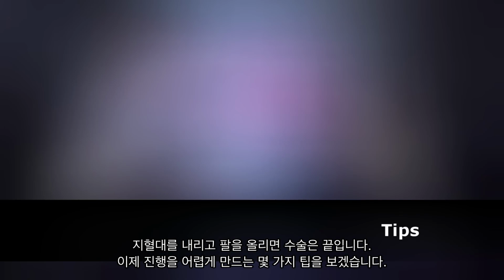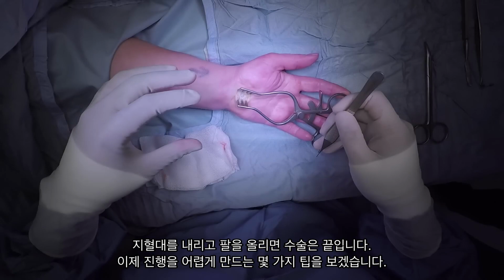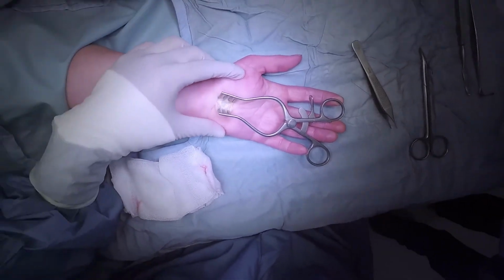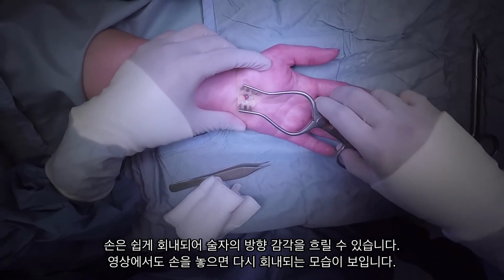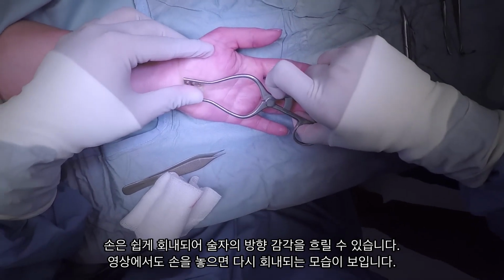This is a relatively straightforward operation, but there are a few tips to help you avoid difficulty. Some of them we've already touched on, but it's probably worth going into them in a bit more detail. The first thing worth mentioning is that the hand has a tendency to pronate, which can throw you off course without you realizing. It's quite difficult to spot, but in this video you'll notice it when the surgeon pushes the hand back to lie flat against the armboard. A little bit later on, he's keeping the hand supinated with his index finger, but when he takes his hand off, the same thing happens each time.